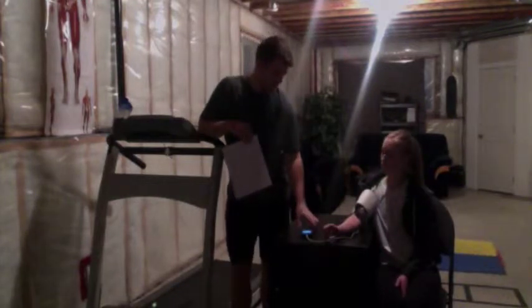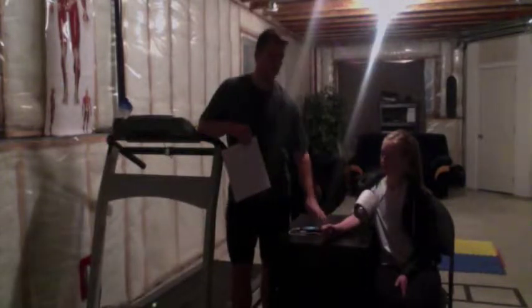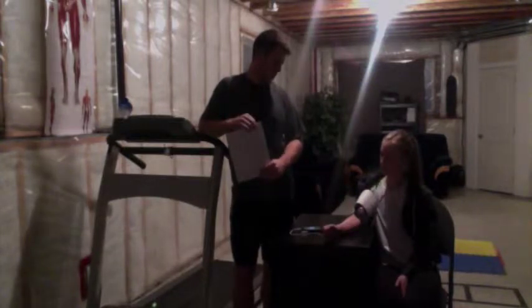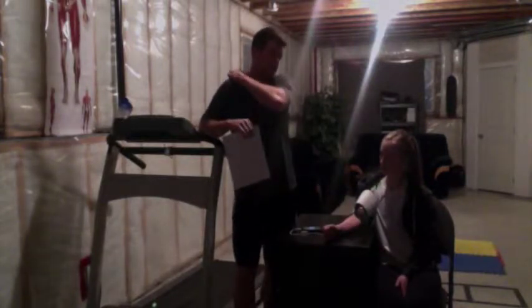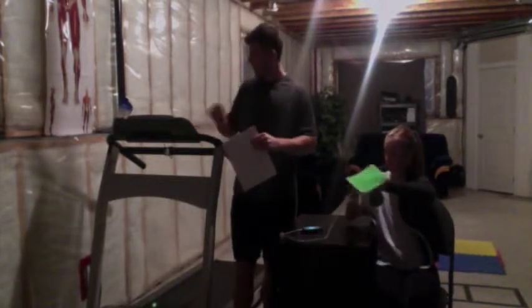So that means we would have increased the test actually half a mile per hour every minute. Okay, so a break from that, her blood pressure is 123/79, which is well within the norm. Her resting heart rate is 76. Okay, Kaylee, I'll get you to take that off, and you can start walking on the treadmill here.